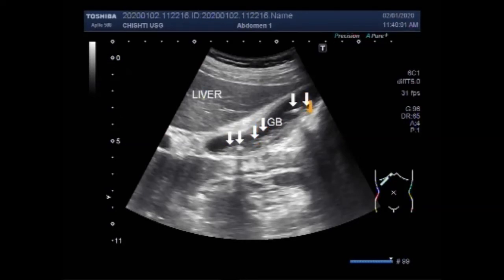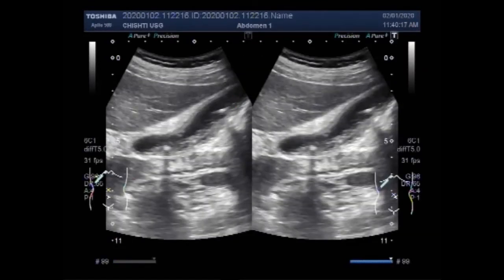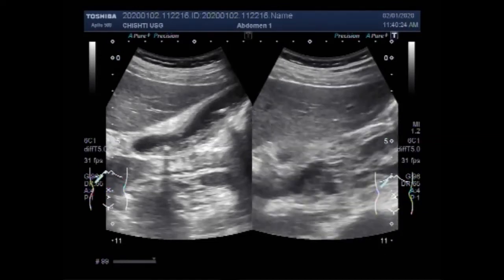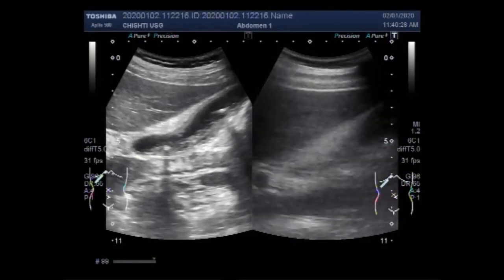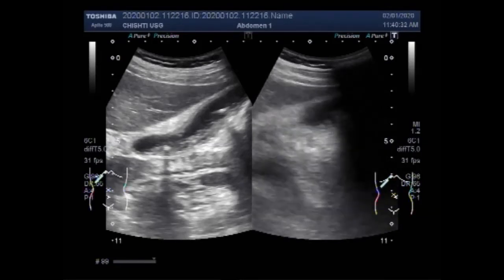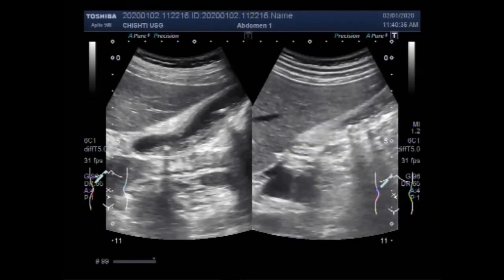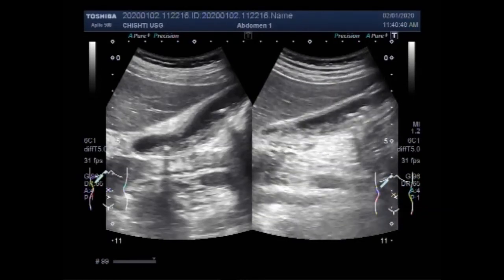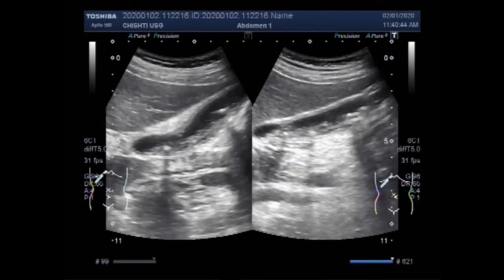The whole length of the gallbladder is filled with thick sludge and multiple small sand particles. Now by changing the posture of the patient to the side-down position, you can see multiple stones — although small stones — along with the small sand particles and thick sludge throughout the whole length of the gallbladder.